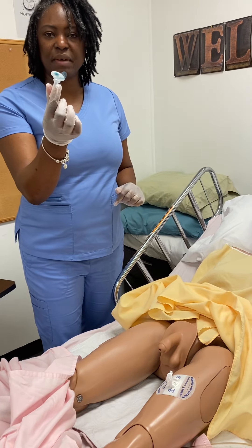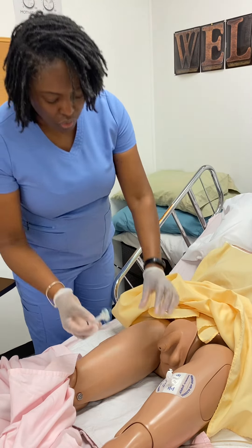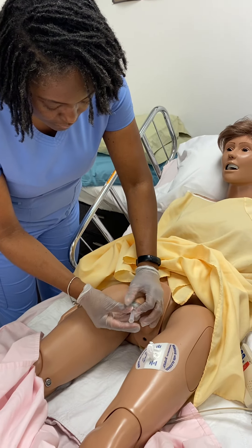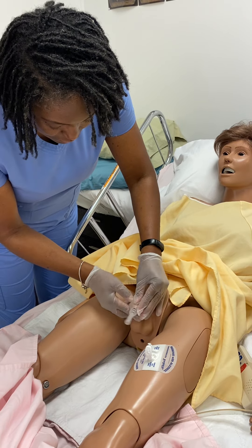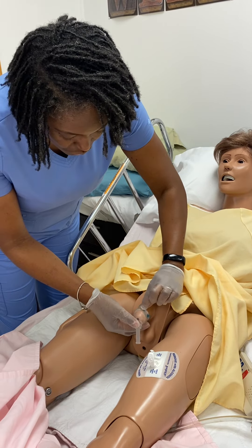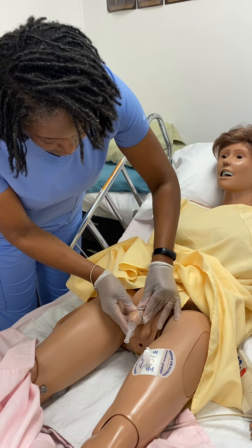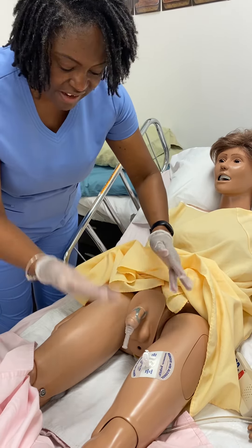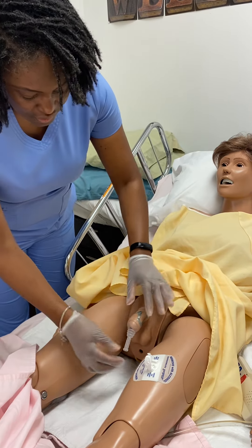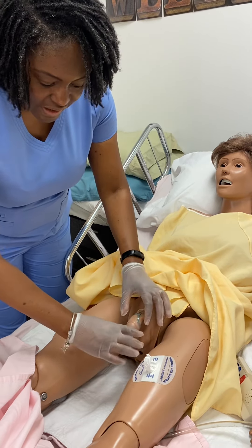This is the condom catheter. This is where we would connect our tubing. We take the penis and we place this here. There's an adhesive inside the condom that causes it to stay. Always leave a little extra here so that the urine can go down.